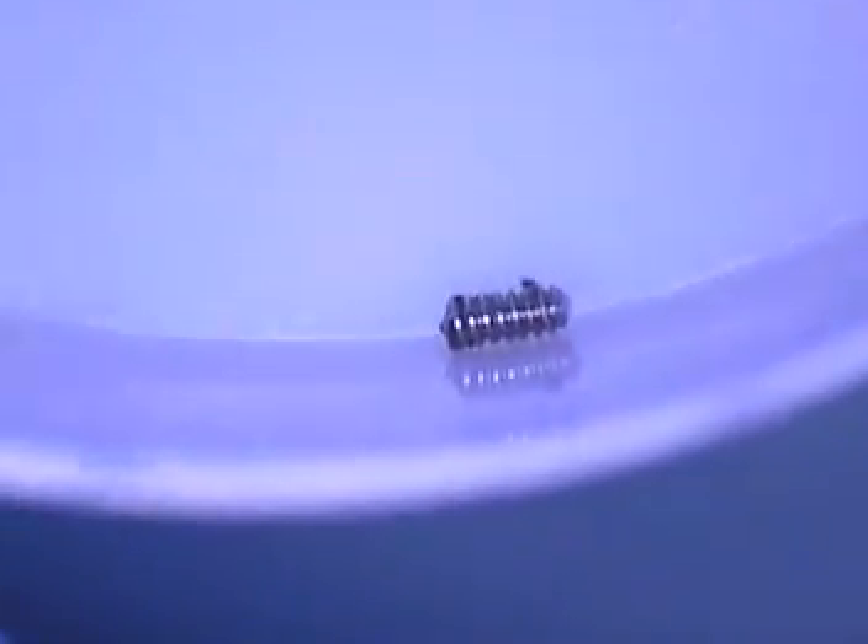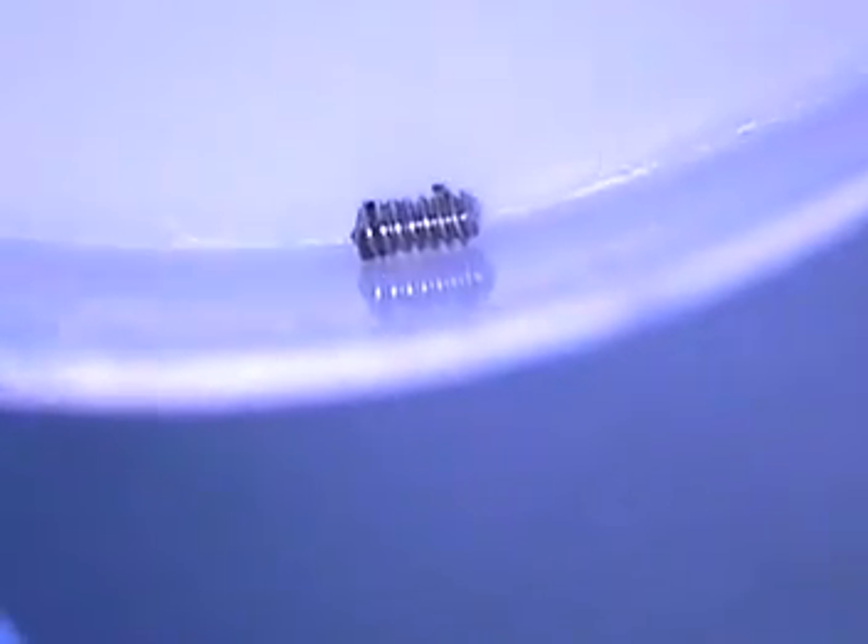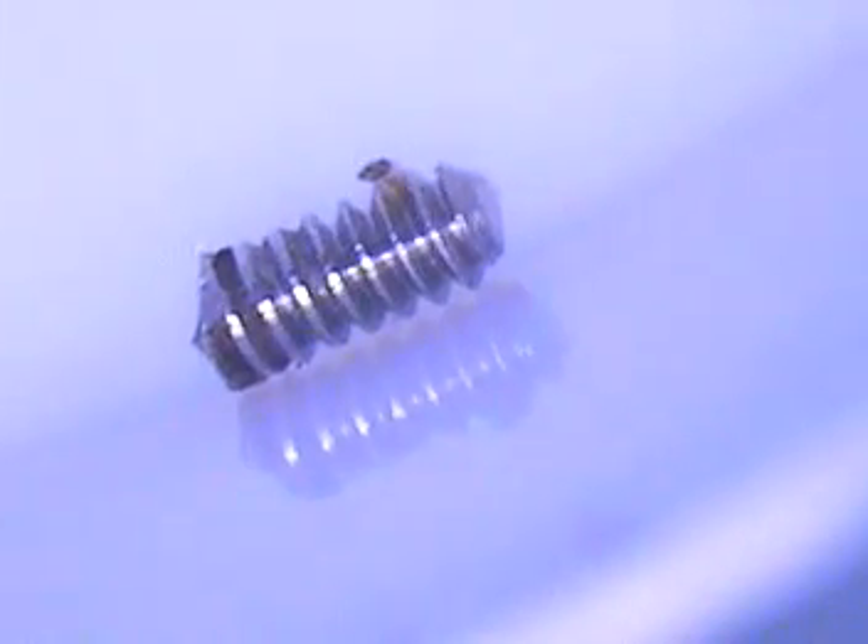Okay, we're back. I'm going to show you that screw we just removed from the mouth. There's one of them — that's the BioMet 3i. You can see a little bit of the bio burden on that. That's the broken screw that came out of the anterior abutment.